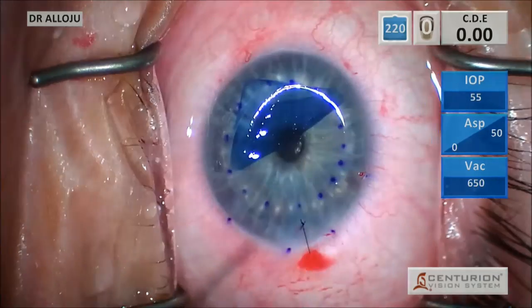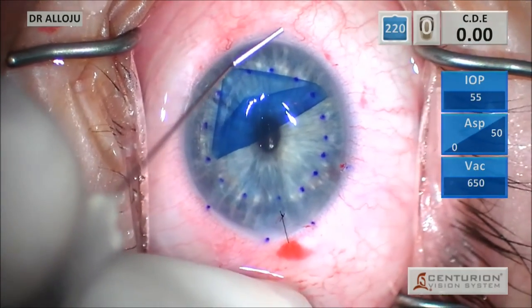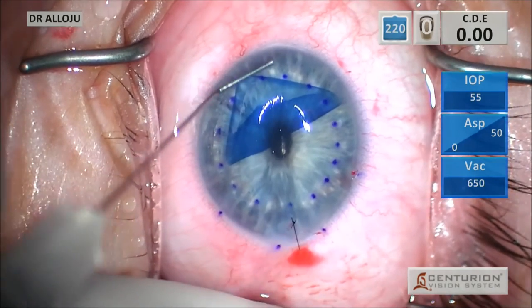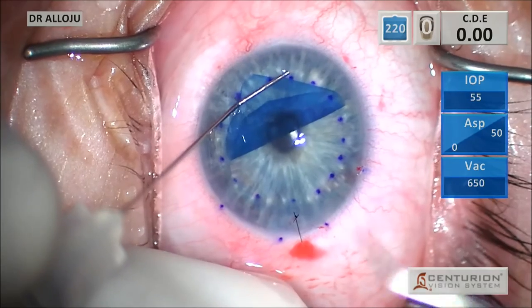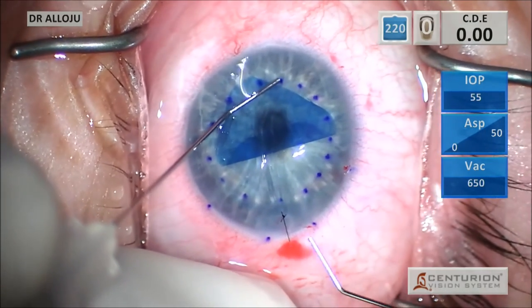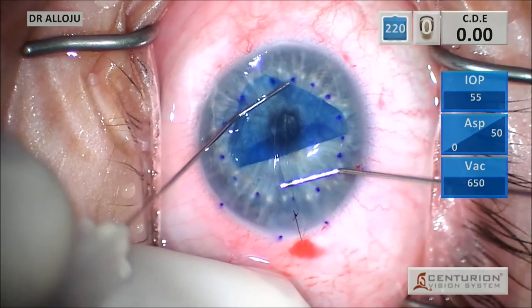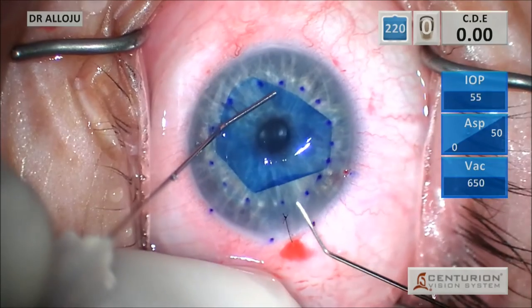So here I'm basically using my middle finger to exert pressure on the eye, positioning the cannula between my middle finger and my index finger to help pin the graft, and now I'm using that negative pressure technique, intermittently shallowing the chamber to get the graft to unfold.